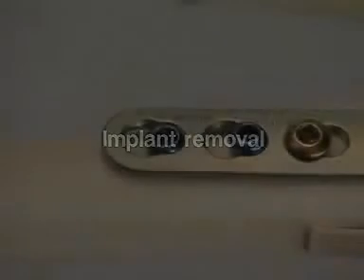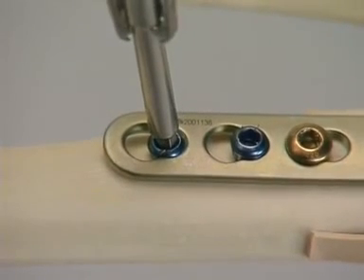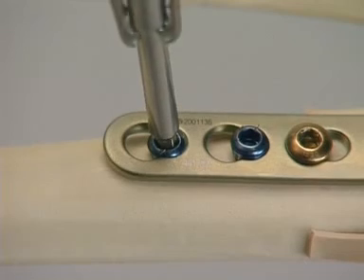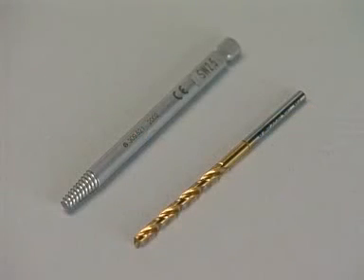When the implants are being removed, certain screws may be so firmly anchored in the plate that they cannot be extracted with the conventional screwdriver. To remove such screws when the hexagonal head is damaged, 2 instruments are available: the 2.5 mm conical extraction screw with left-hand thread and a 2.5 mm drill bit for metal.